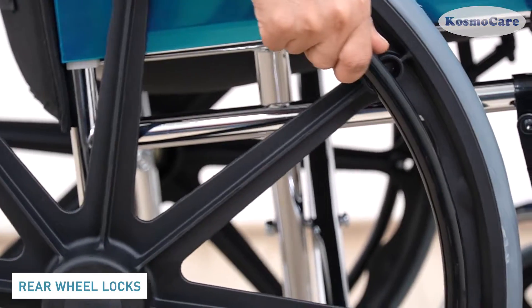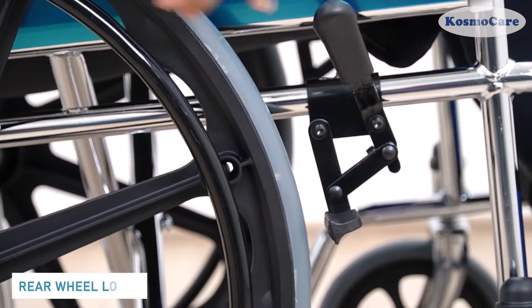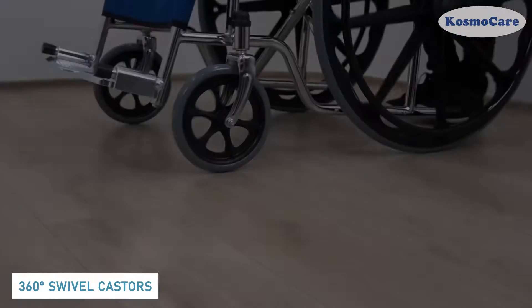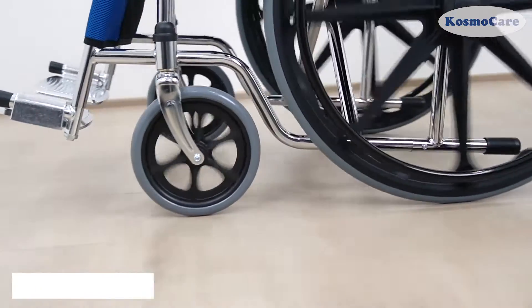And when at rest, this accessible wheel lock lever securely locks the wheels. The solid PVC front casters swivel 360 degrees to maneuver the wheelchair through tight spaces.